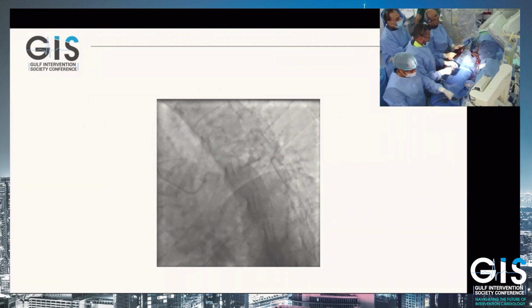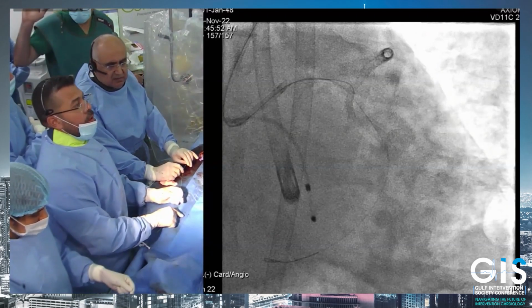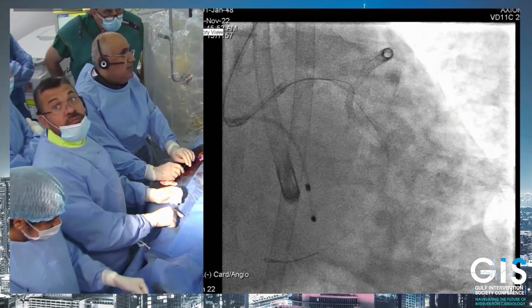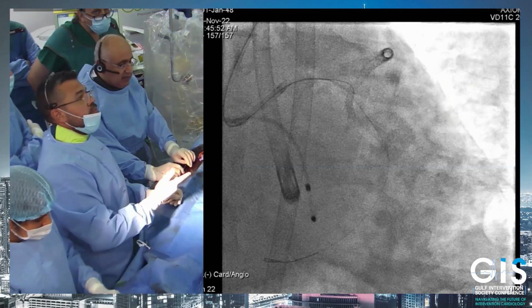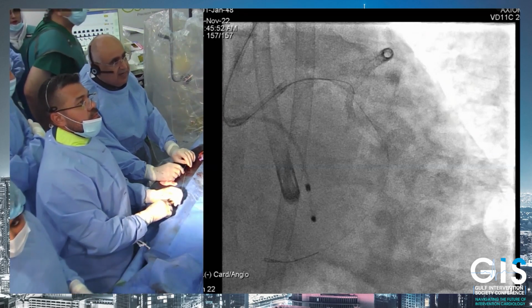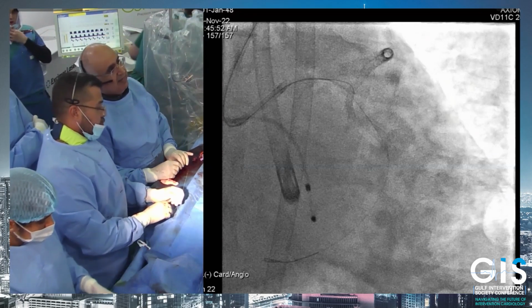So this patient is basically a high-risk case, with quite severe LV dysfunction, 72 years old, chronic kidney disease with creatinine of 150 and reduced GFR. The thing is, he has CTO of the right, severe stenosis of the mid-LCX, and ostial LAD is severely diseased. He has severe, or moderate, in-stent stenosis. Distal LAD is also severely diseased. So all in all, the surgeons turned him down because of poor distal LAD target due to the metallic cage.